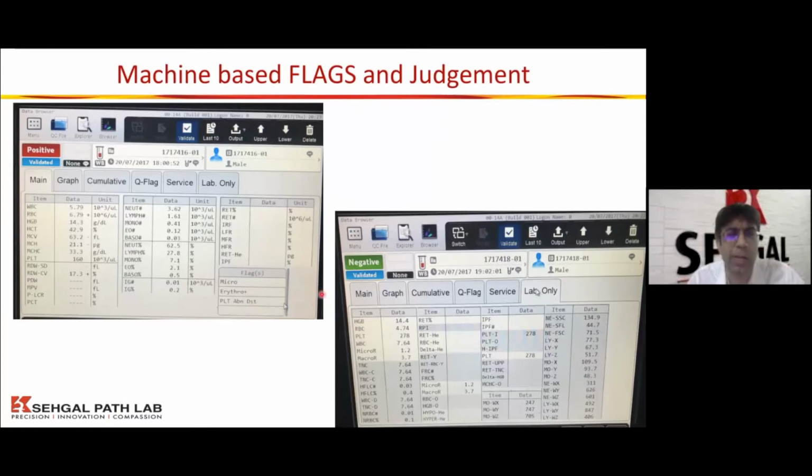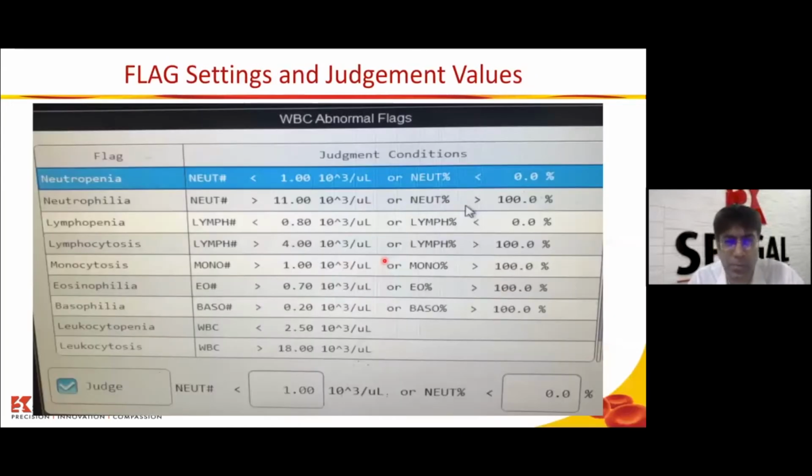And if flags are present, like in this particular case, the machine has given flags like microcytosis and erythrocytosis, because MCV is really low at 63 and the RBC count is 6.79. The judgment of the CBC sample for a pathologist review is positive. Please evaluate this case. In this example, there are no flags given by the analyzer, and the judgment of the CBC machine for the technician and pathologist is negative. No need to review this case, is what the analyzer is telling you based on its own judgment.